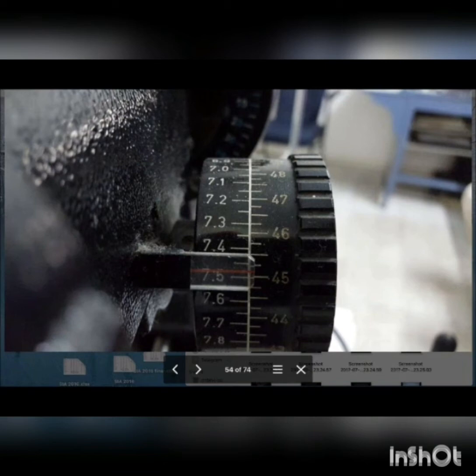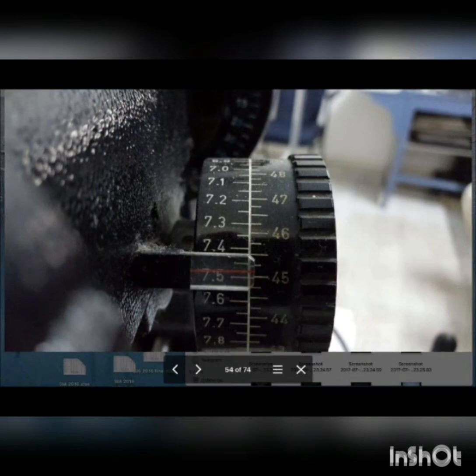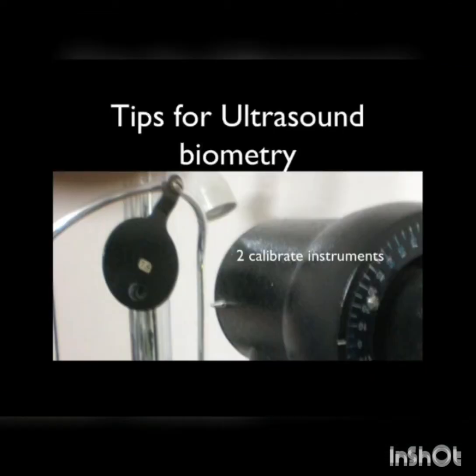Here we see a picture of a keratometer and you can see the red line is slightly above the 45 diopter mark. Usually we would note this down as 45, but to be more accurate — although it's not close to the quarter mark, not close to 45.25 — we have to note this down as 45.1. These small steps will make our biometry more accurate.